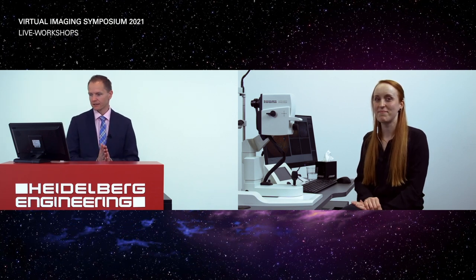Okay, so then to the next question, I would like to ask you to open the acquisition window, please.